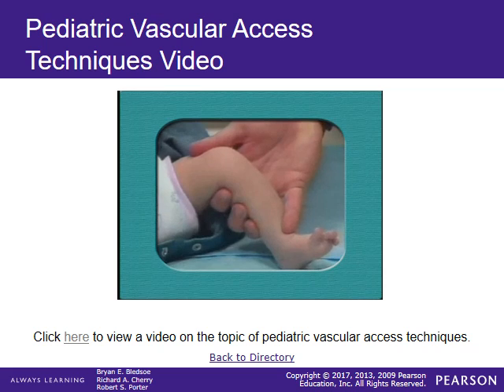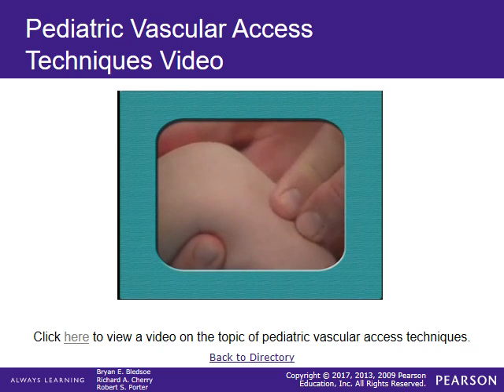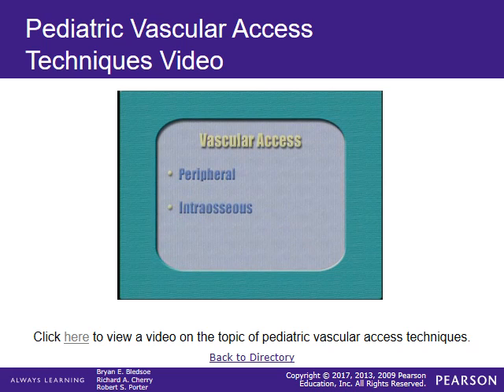Because it provides large-bore rapid access, intraosseous technique is now recommended for children of all ages in which you cannot obtain IV access and for which you need this access through an emergent condition. Other than these two, the only other method available is the use of central veins.